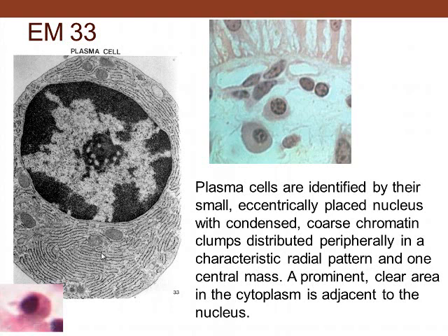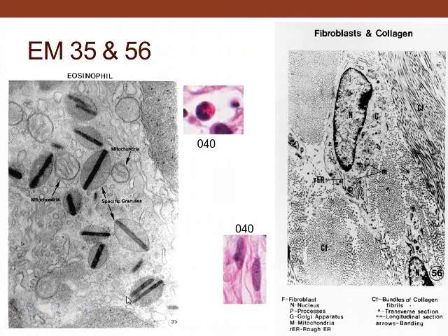The rough endoplasmic reticulum produces antibody protein. In an H&E preparation, the large plasma cell is visible with a Golgi apparatus nearby — seen as a clear region. Looking at EM35, we see an eosinophil with a lobulated nucleus and large red granules. These granules are large relative to the mitochondria and contain a crystalline core.